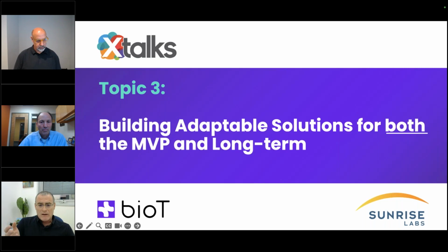Now, let's drill down a bit more specifically to actual points. First one is how you connect to the cloud. You have many ways to do that, and it's basically setting dependent. If you are in a hospital, it's one thing. If you're in a clinic, it's another thing. And if you're at home, it's a different thing. In general, when you're talking about connectivity, you have two main items you need to consider as pros and cons. One is how costly is this way to connect, and second, how complex is it to connect in this way, meaning configurability.